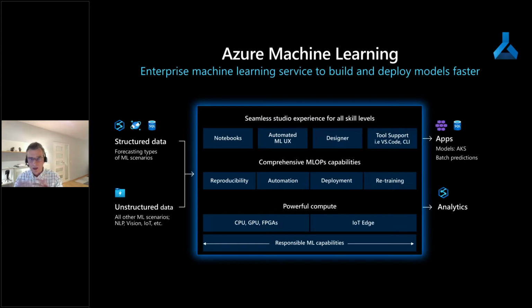And the topic in the industry which supports that is called machine learning operations, MLOps, and the platform that we are leveraging here today for those medical use cases, Azure Machine Learning, supports these MLOps use cases. So at the bottom, you see compute resources that you can leverage for training these kinds of models, but also for production, for deploying these models as a web service so it can be used in the clinical setting.